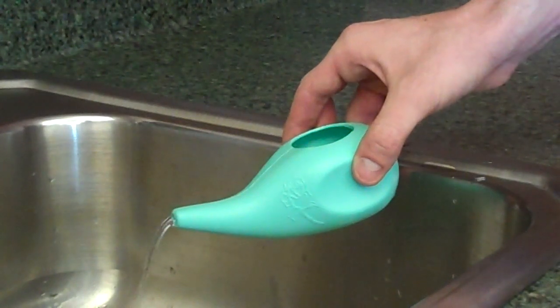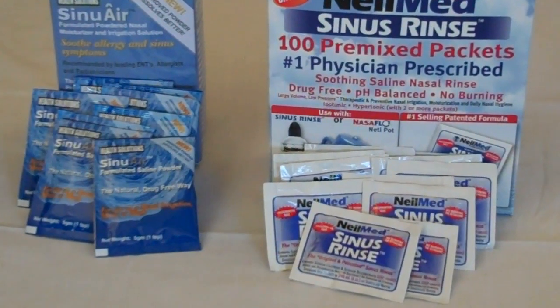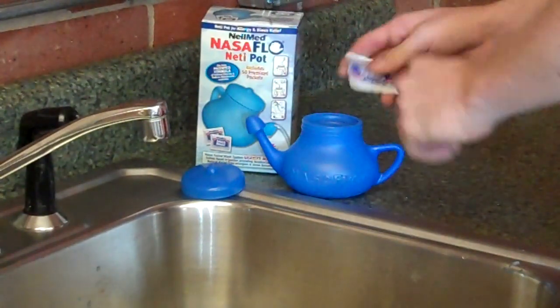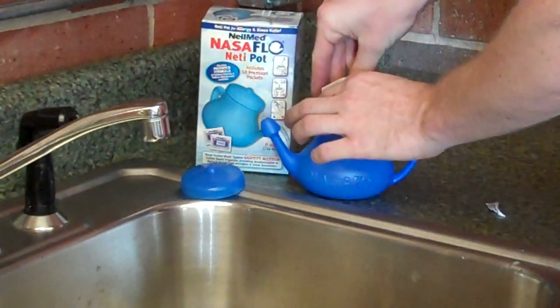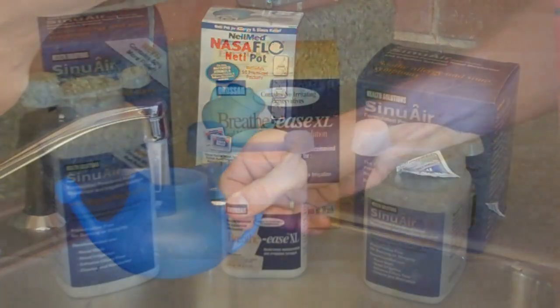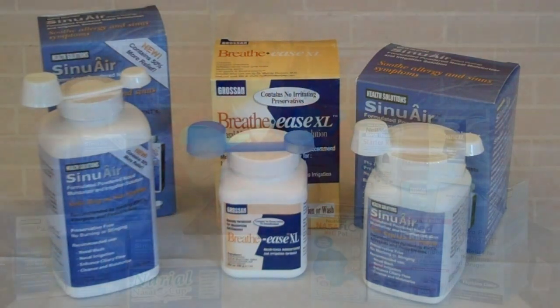Developed in India as part of yoga, neti pots gently bathe your sinuses in a saline solution. You can add water to pre-mixed packets — simply pour one into the neti pot and then fill with water. Or, use a formulated powder to mix an isotonic or hypertonic solution made specifically for your needs.